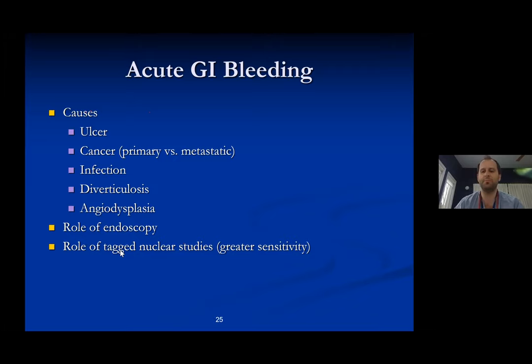You just have to be very, very careful here, because if you cause too much non-target embolization, you can cause ischemia and the patient will end up with a dead bowel, which requires surgery. Then splenic embolization, we most commonly perform in the setting of trauma. Blunt trauma, but it can be penetrating trauma too.